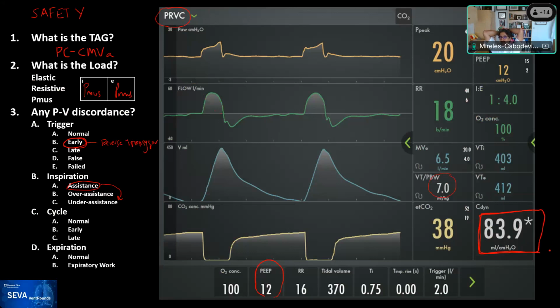And so this is, I'm not going to make a determination right now because I don't think that we have the full amount of evidence out there, but this is a very high amount of effort being generated by the patient with very injured lungs.